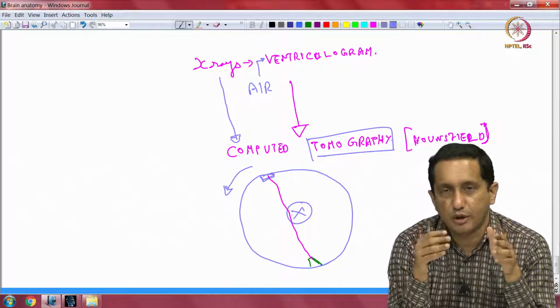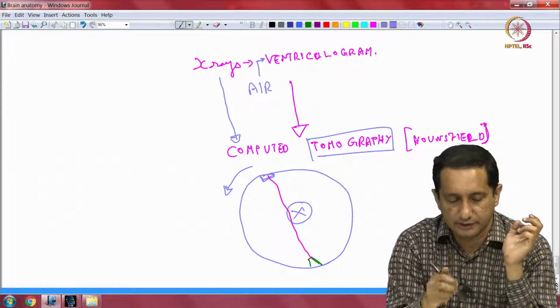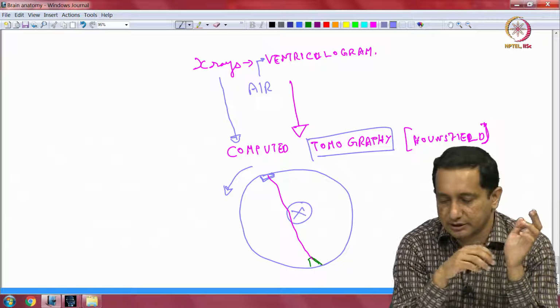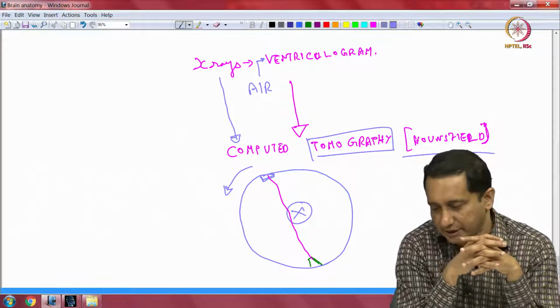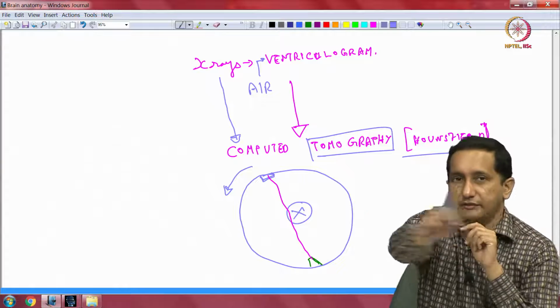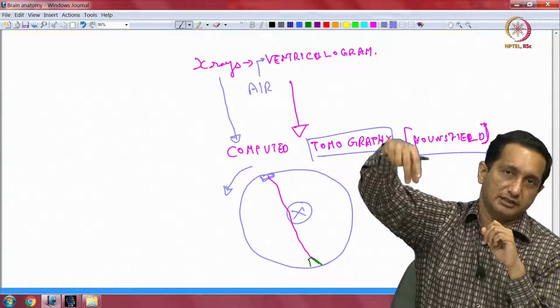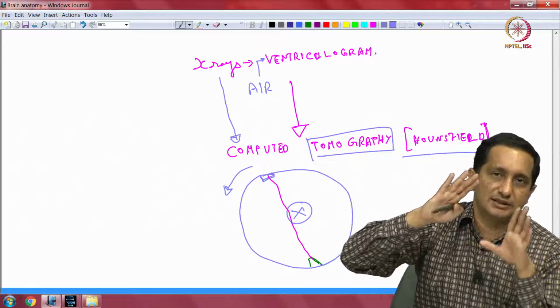Tomography in the sense that you get points on a circle where you get density measurements of these X-rays, and by which you reconstruct the material. The algorithm which is used for reconstruction basically got the Nobel Prize, and that's in very brief terms what a CT does. So CT is basically an extension of X-ray. X-rays pass through the body across a curvature, and you get the density values collected on the opposite side, and based on the density values you infer what is the density in the center. That algorithm put on a grayscale is what a CT image is all about.